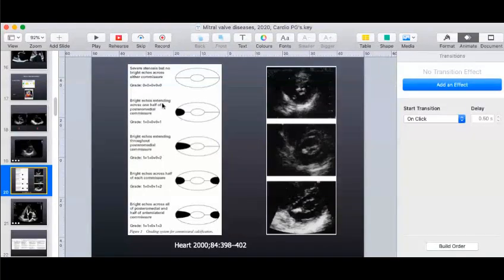I would not really focus too much on the grading. But as far as publication is concerned, you should be able to know. When you're going to use it for general use, it has still not come into the expert document. So there is no need to focus too much on the grading. The description is much more important: whether it is one commissure, and if it is one commissure, whether it is the complete commissure or half the commissure.